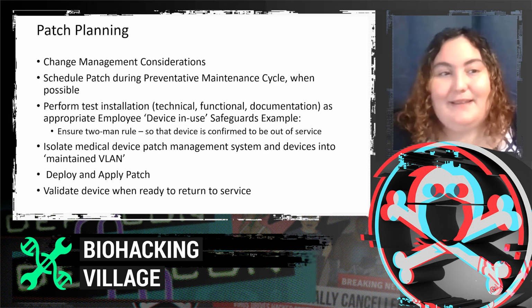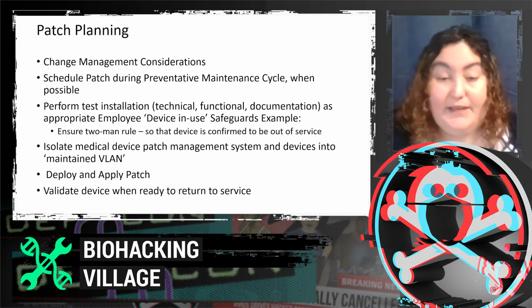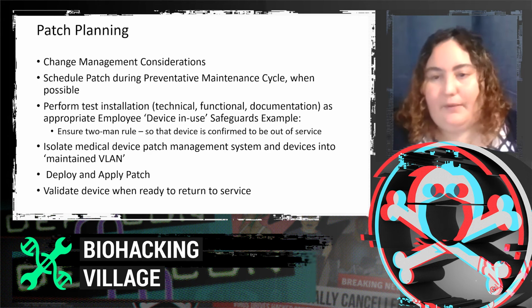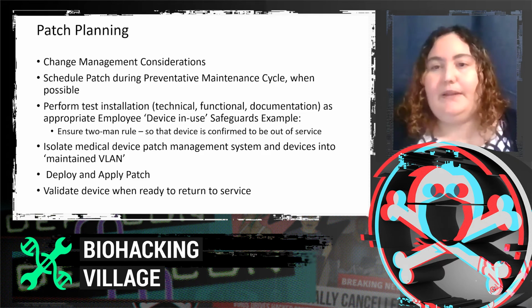So that is our patch planning. I know it's a little more involved than the automated patch deployment that you can do with your workstations and servers, but because these devices are so important to clinical workflow, we need to put in this effort.